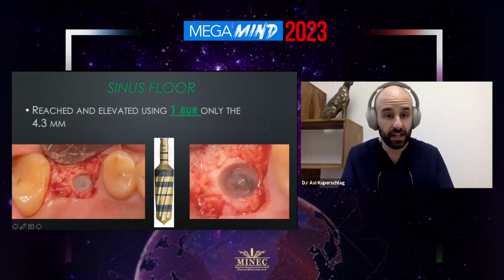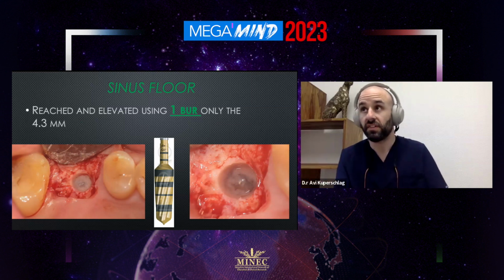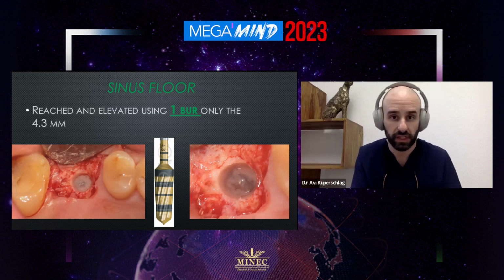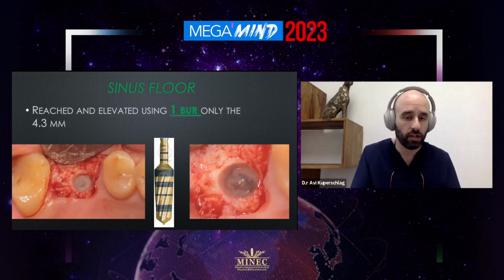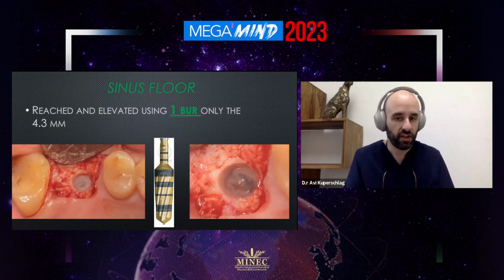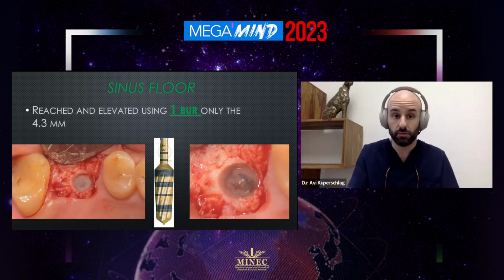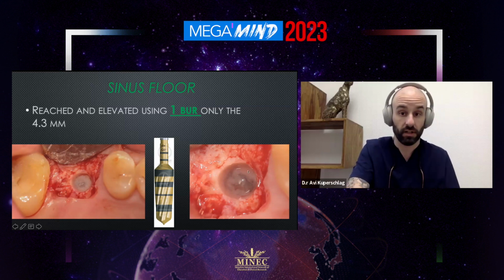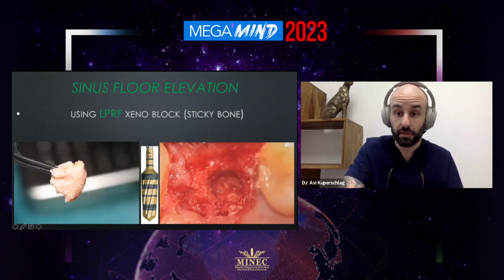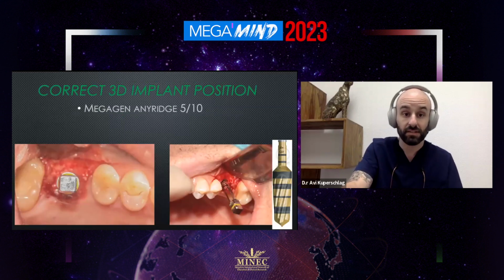One of the reasons that a lot of clinicians like to avoid crestal approaches is visualization. This is what we are being taught in the maxillofacial department. The first rule of surgery: you don't see, you don't do. Well, this is the sinus floor. We can all see it quite well. This is the grafted sinus that we can all see quite well. Everything is very, very nicely visualized.